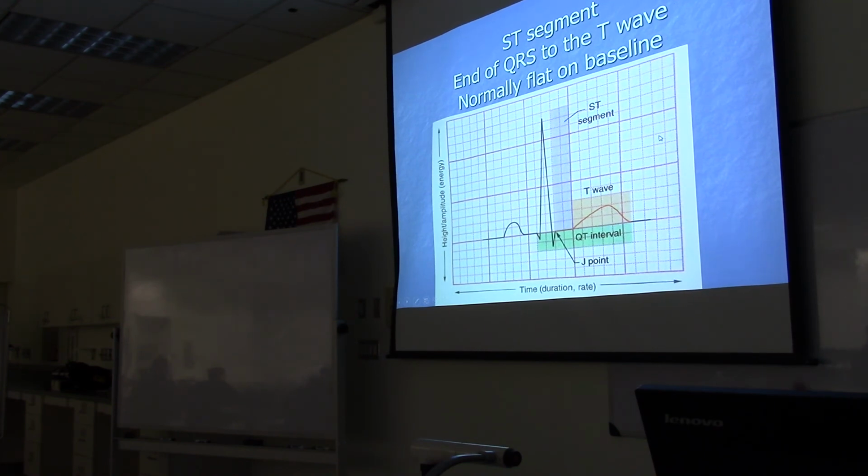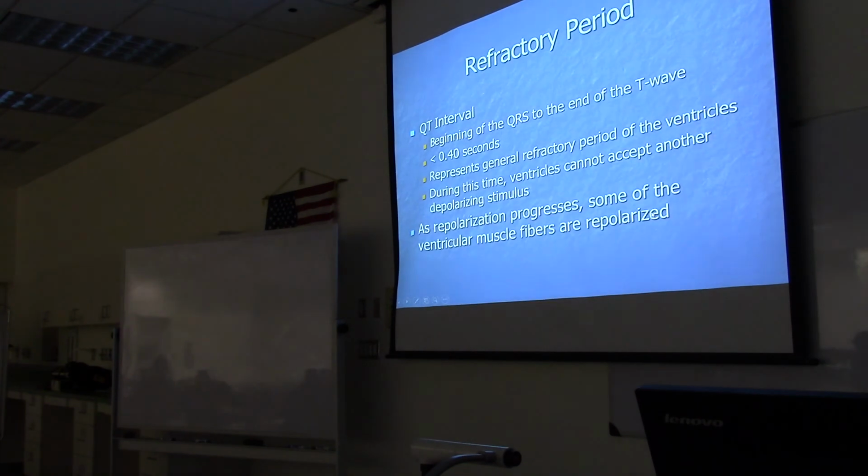So we'll take a look at yours. You guys are going to get a tracing of your EKG, and then I'll have you tell me all these things after you get the tracing. Okay, so the rest we'll do after lunch.